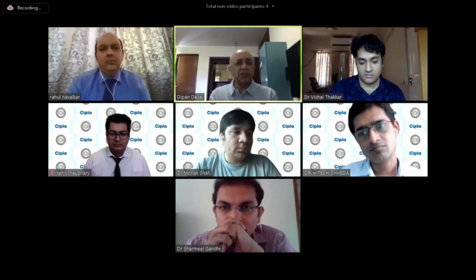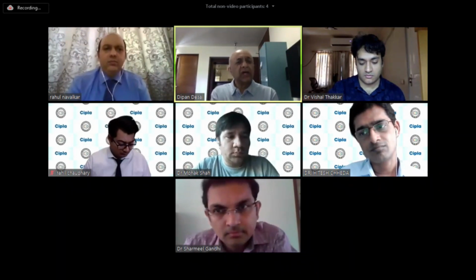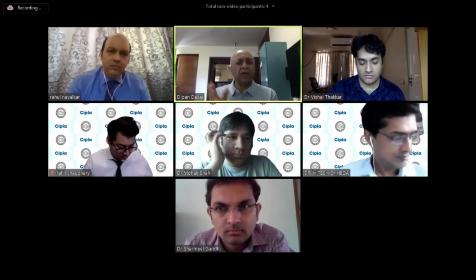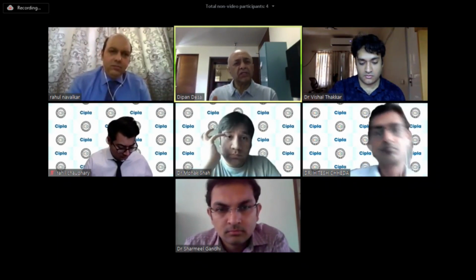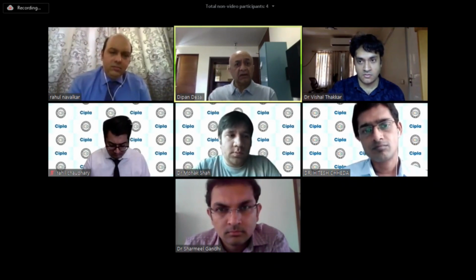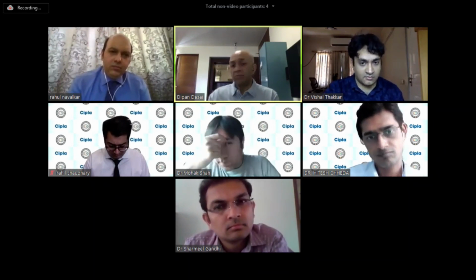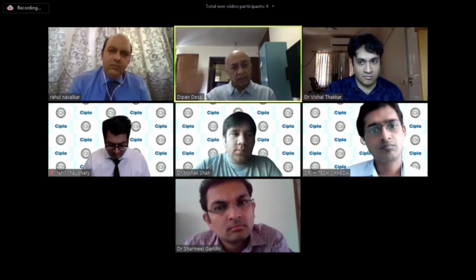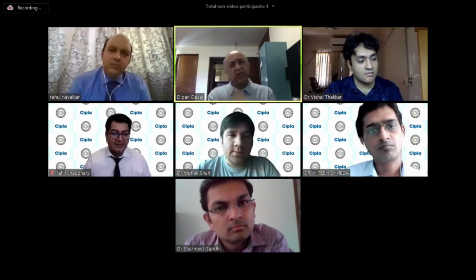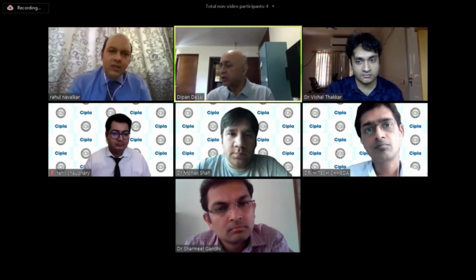Most important is counseling in these patients. Their expectations, usually these refractive patients are a little high, even though their corneas and eyes are bad. So if you are able to counsel, then if you are beyond 1.5 diopters, I think you can safely, after studying the Pentacam and seeing on the Holladay program what is the status of the cornea, how irregular it is, then we can go and do astigmatism correction with toric lenses.